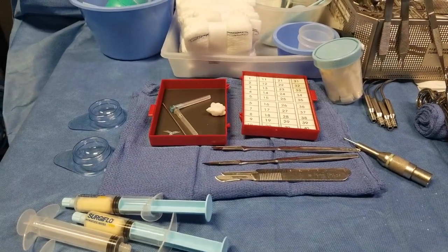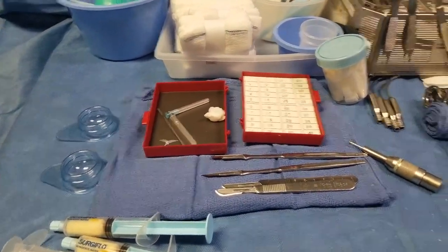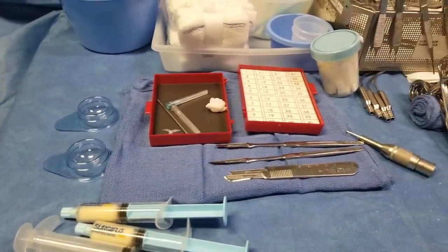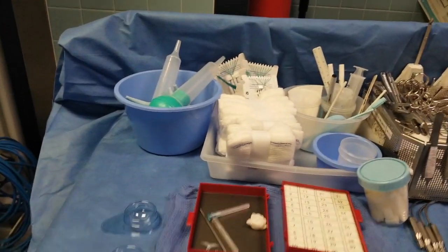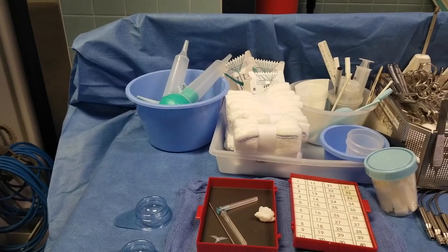My sharps container holds blades, hypos, any burrs — anything sharp that is needed. I also have a bucket to put on my Mayo stand that is going to be regular saline.